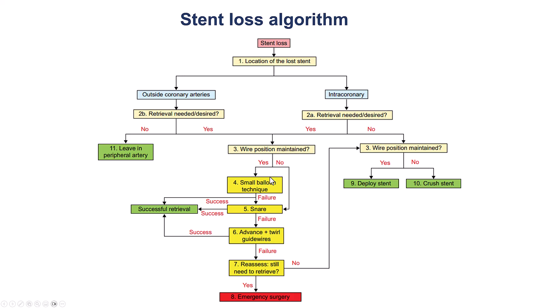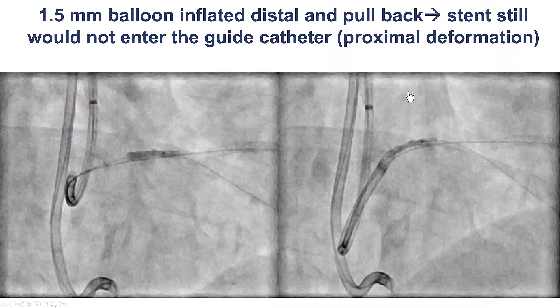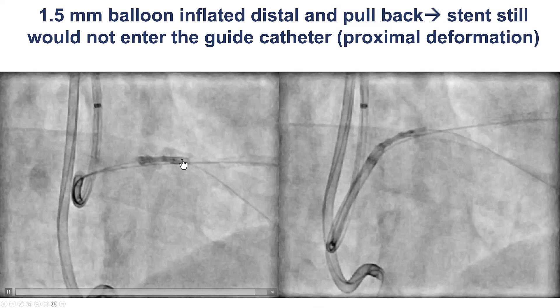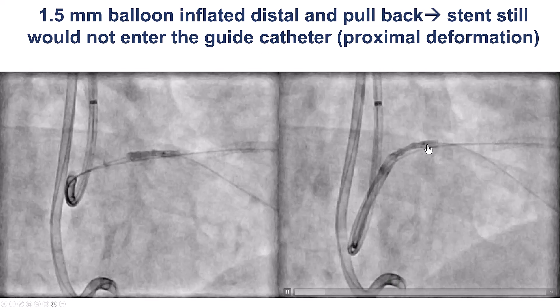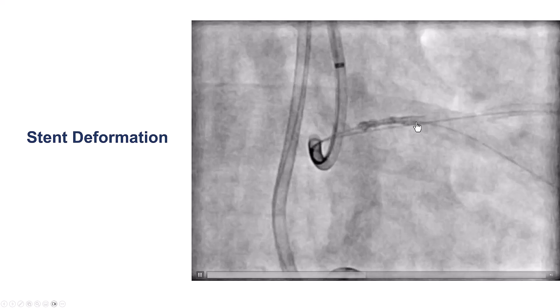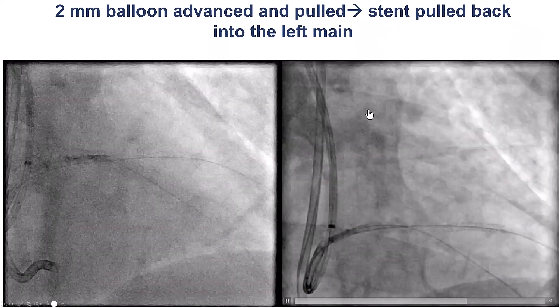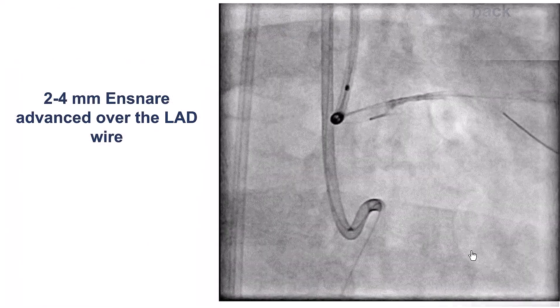When trying to remove a lost stent, the most common technique is the small balloon technique: advance the balloon distally, inflate it, pull it back, and bring the stent back along with it. We tried with a 2.0 mm balloon but could not get it through the stent. We tried a smaller 1.5 mm balloon, inflated it distally, but because of the proximal stent deformation, we could not bring the stent back into the guide catheter. The stent was deformed both proximally and distally. A 2.0 mm balloon brought the stent back into the left main, but it still could not enter the guide catheter.